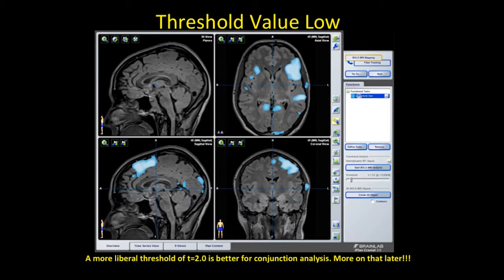Eyeballing it, you can see there is a left-language hemisphere dominance. The laterality index is favoring the left, you have a good robust Broca's area activation, and also a posterior temporal — likely some receptive Wernicke's area activation.